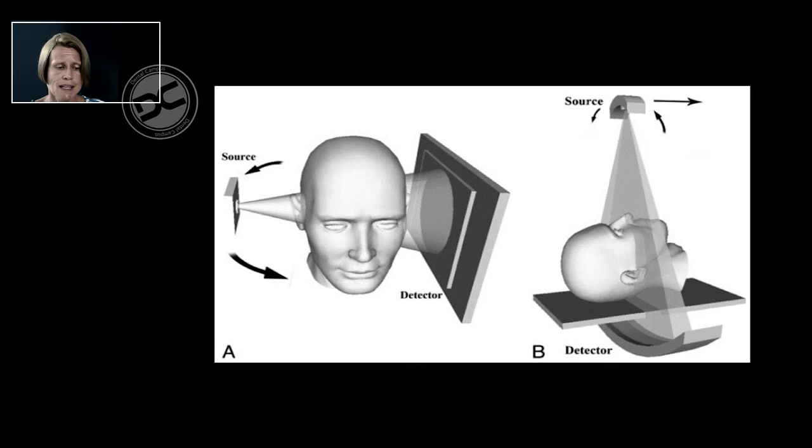With the multi-slice CT machines, the patient is actually placed on a bed that is moving through a cylinder where on the one hand you have the X-ray tube and on the other hand you have the detector arrays. And thus you have to compose your image in the multi-slice CT with various layers scanned one after the other.